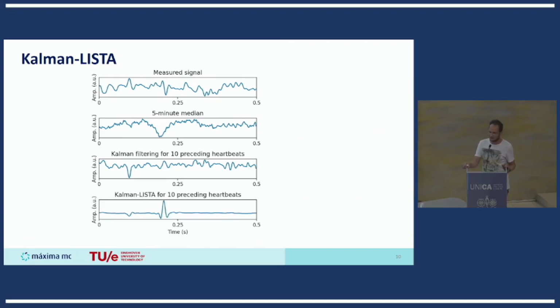And if we apply our Kalman LISTA algorithm using only 10 heartbeats preceding, this is the output that we get, which to me was very remarkable and very impressive when we got this. We actually questioned whether we made a mistake because it was too good to be true almost. But we have convinced ourselves now that it really works as we think it works, and even better, but it's really true.